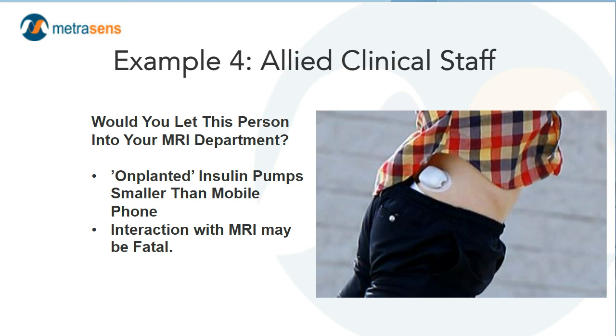So simply assuming the process of emptying your pockets is sufficient to conduct the screening is not correct. And simply patting somebody around their waist may or may not do the job either.